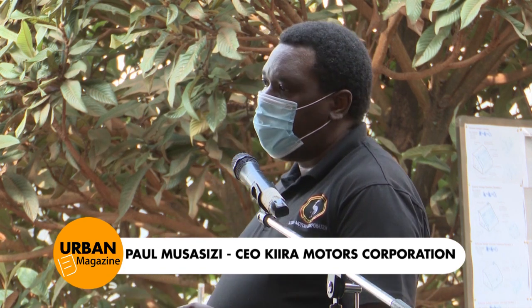Our goal is ultimately to see that the supply chain is localized. So as we are working, we are ensuring that a lot of the work is actually being done here. In this ventilator, we have made the printed circuit board. That's like the motherboard of the ventilator here, where we have the brain of the ventilator and a few other electronics. We have made the casing here.